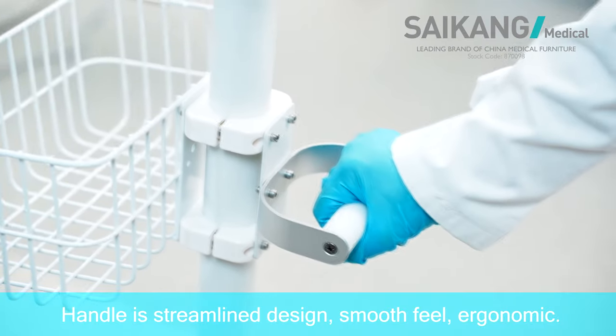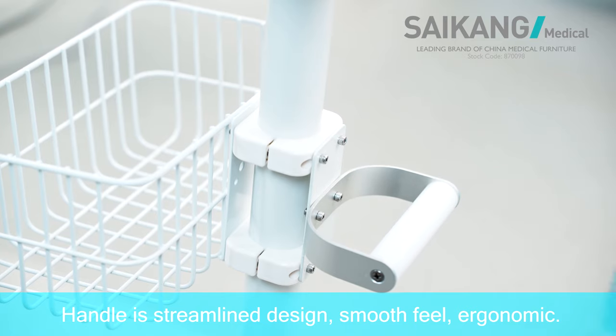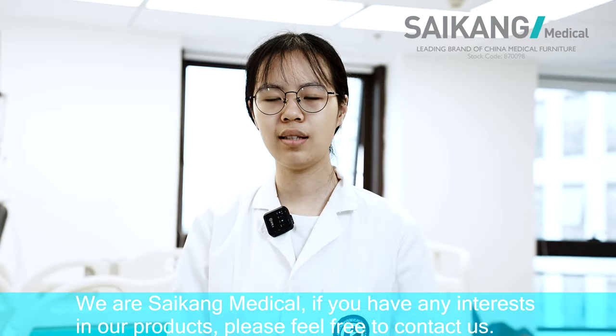The handle is streamlined design, smooth build, economic aluminum tray, firm installation. We are Saikon Medical.